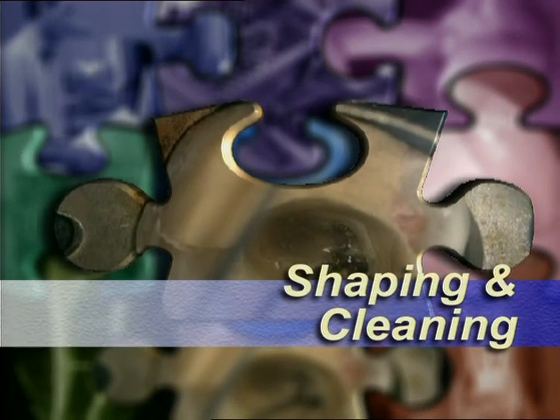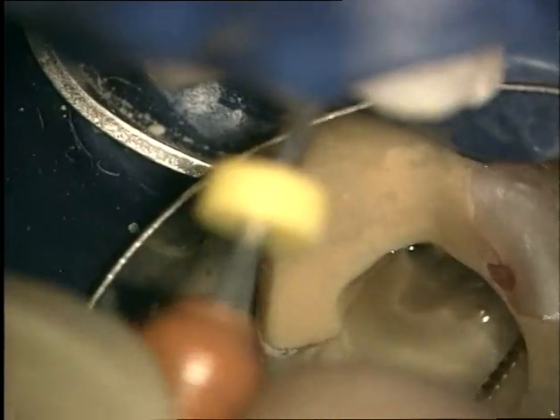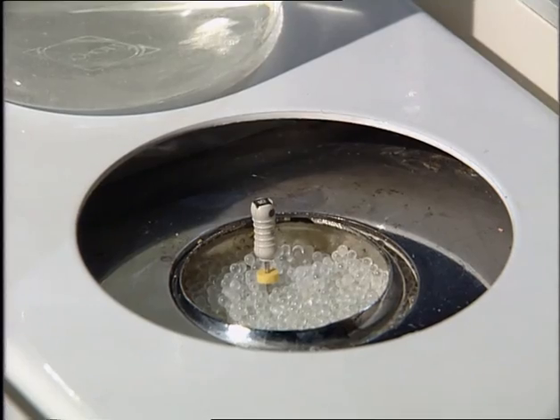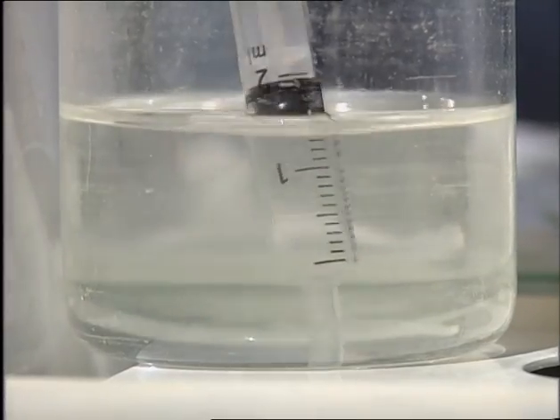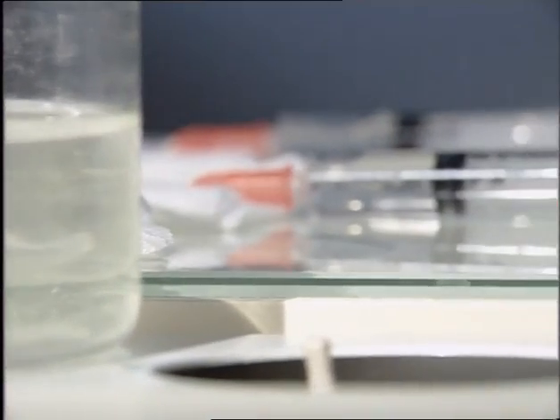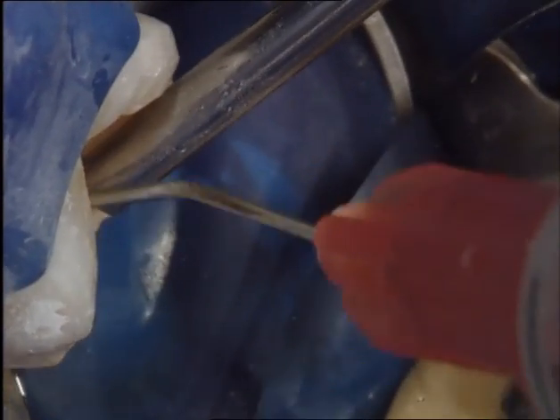The secret to successful clinical endodontics is proper cleaning and shaping. Cleaning refers to the removal of the entire organic substrate from the root canal system, for example, organic debris, microbes, and microbial byproducts. Sodium hypochlorite dissolves organic tissue, microbes, and toxins in the root canal systems. It also acts as a lubricant and keeps the dentinal mud in a loose suspension. Sodium hypochlorite is used constantly and without any pressure.